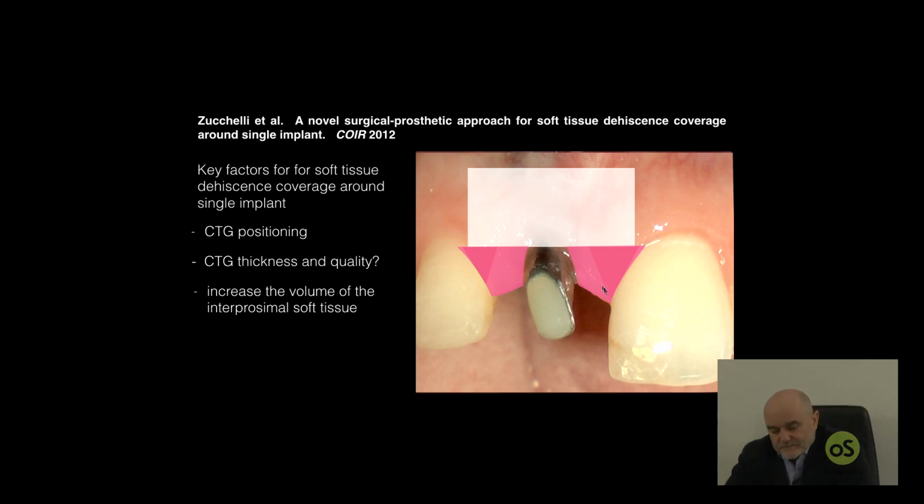So it is exactly the same topic that we covered when we spoke about periodontal regeneration procedure. It's a completely different story when you can manage with the soft tissue of a papilla shape, triangular, with only epithelium, with respect to a trapezoidal shape in which you have a soft tissue isthmus that can be used clinically to extend your desepithelialization towards the palatal aspect.